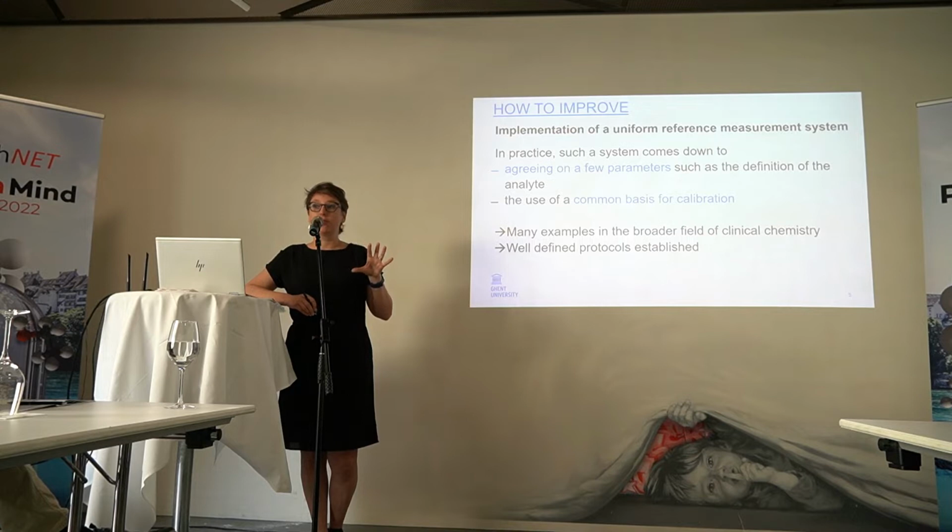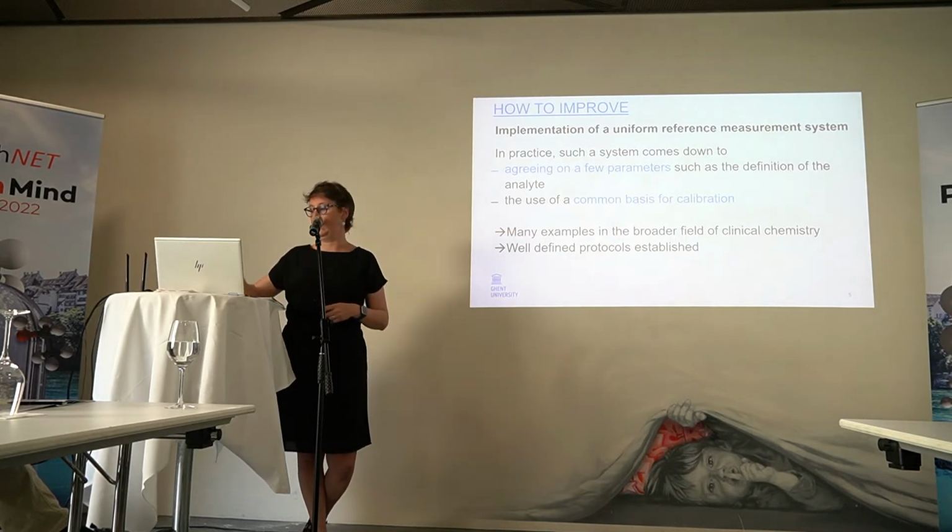One of the most successful ones is hemoglobin A1C. This concept has been around for over 30 years, and there are many well-defined protocols established. So I'm not just inventing something, it's based on what we have done for years in the field of clinical chemistry.